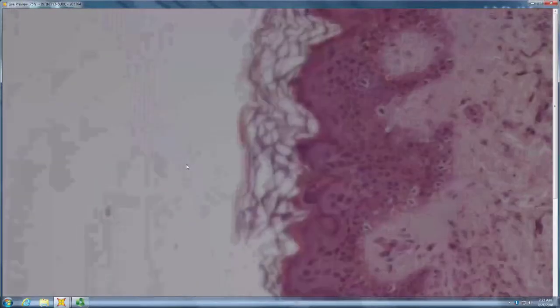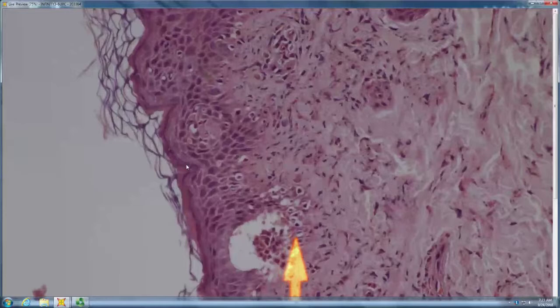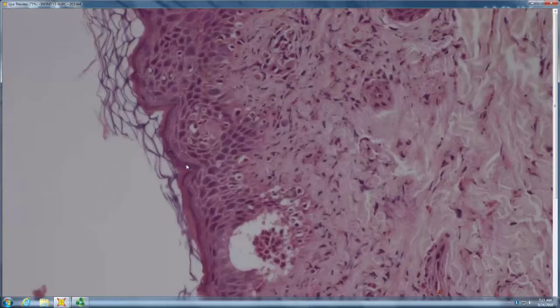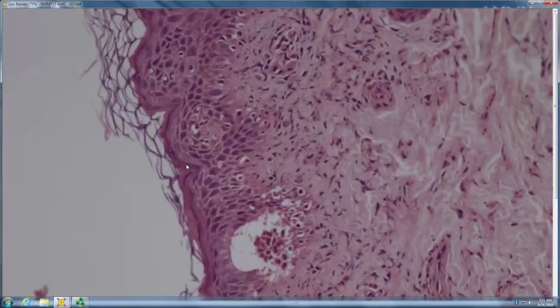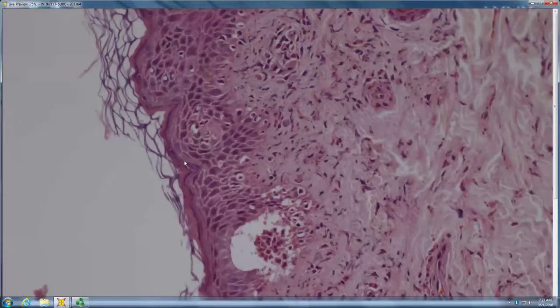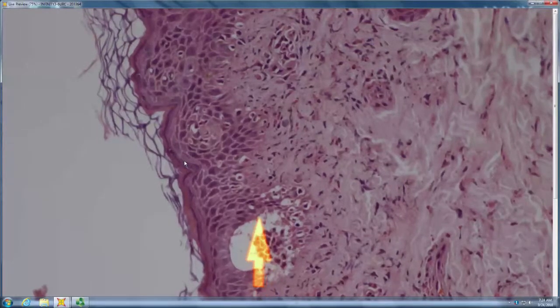There could be a little reepithelialization below, but it looks like rather than being a clean split, you have some necrotic keratinocytes. You have necrosis of the basal layer. So thoughts? Maybe more along the EM spectrum. So that's a very good thought. Could it be something EM, TEN, fixed drug, and then the neutrophils would be that there is some erosion or excoriation out of plane of section that's recruited the neutrophils. That's a very good thought.